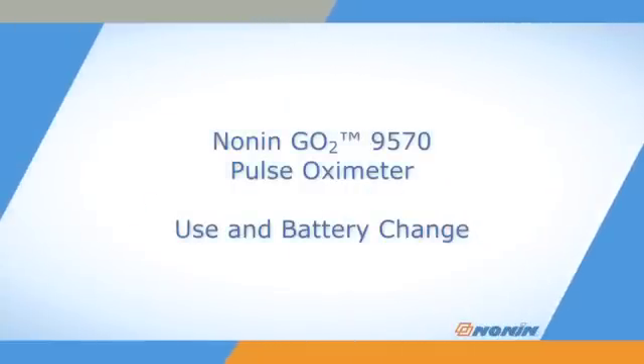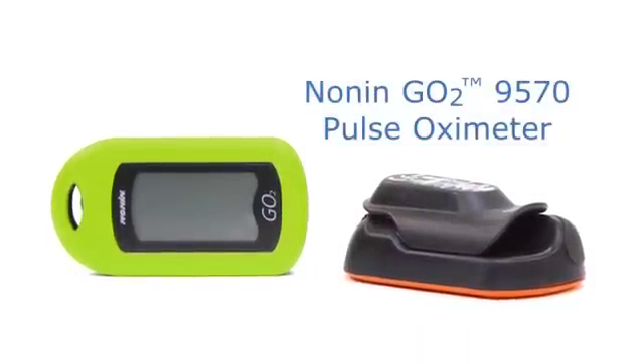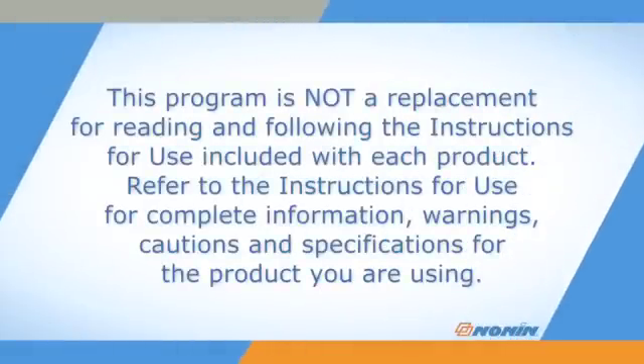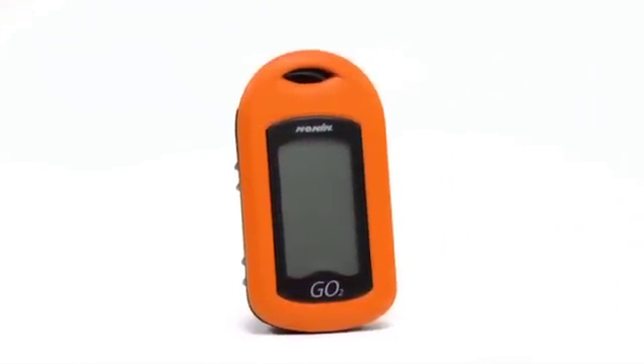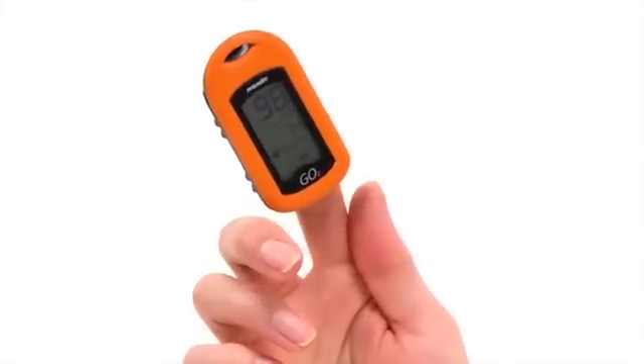This short video shows how to properly use the Nonin 9570 GO2 Pulse Oximeter. The GO2 Oximeter is a very convenient all-in-one device that measures oxygen saturation or SpO2 and pulse rate.